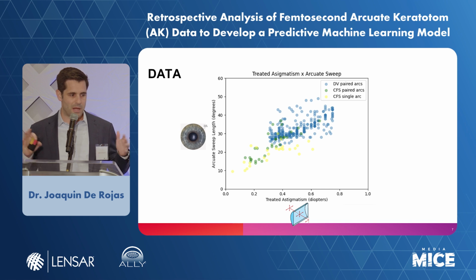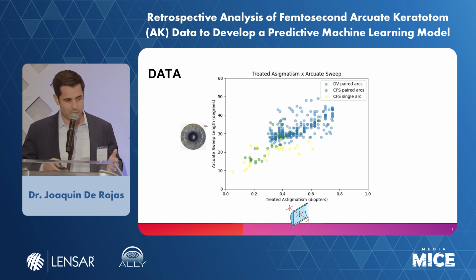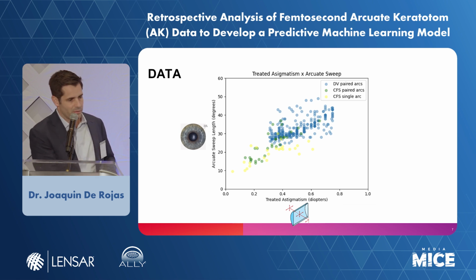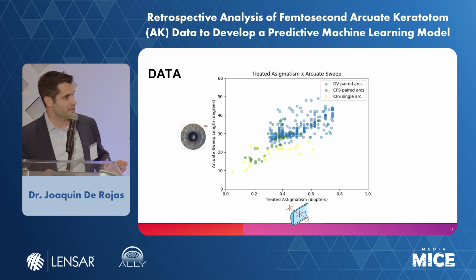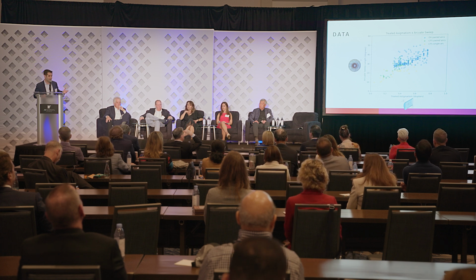This is just a plot of some of our data. You can see treated astigmatism, that value I described, on the X, and the length of the arcuate on the Y. I don't have the laser pointer, but obviously the trend here is that it's upward sloping. But if you look at 0.5 of treated astigmatism, there are a lot of points it could fall on. So clearly, treated astigmatism is not the only thing that matters. There are other factors at play. And that's the point of doing a machine learning model, because then you can start putting in these other factors and seeing how you get even better.